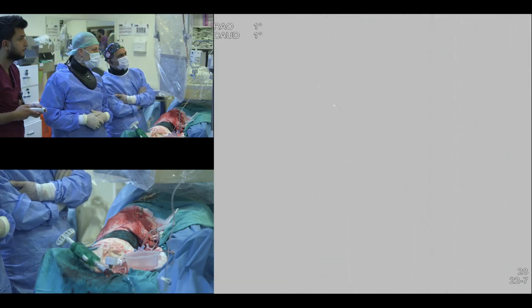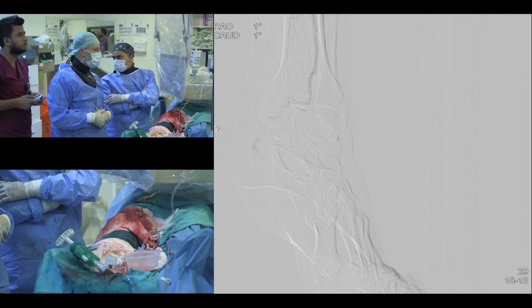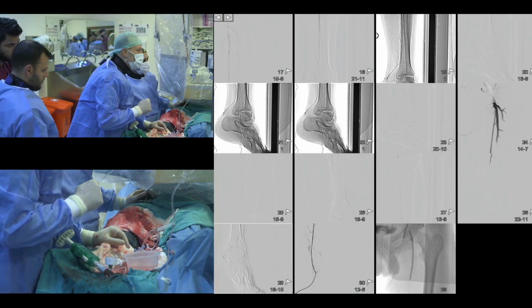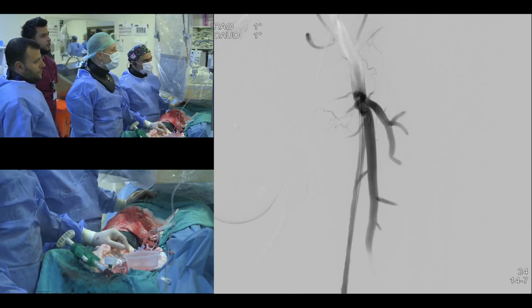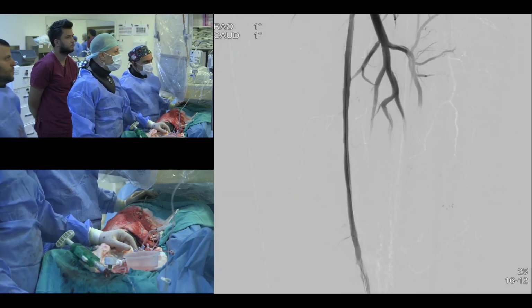So this is after I did the angiogram, there's a stent here, the biodegradable, there's a coronary stent here, and this is at rest. This is with plantar flexion. This is with dorsiflexion. You see what happened to the popliteal? When I moved his foot up, the tendon or the band from the calf muscles shut down the popliteal completely. And this is again with plantar flexion. It took me less than a minute to get these pictures.